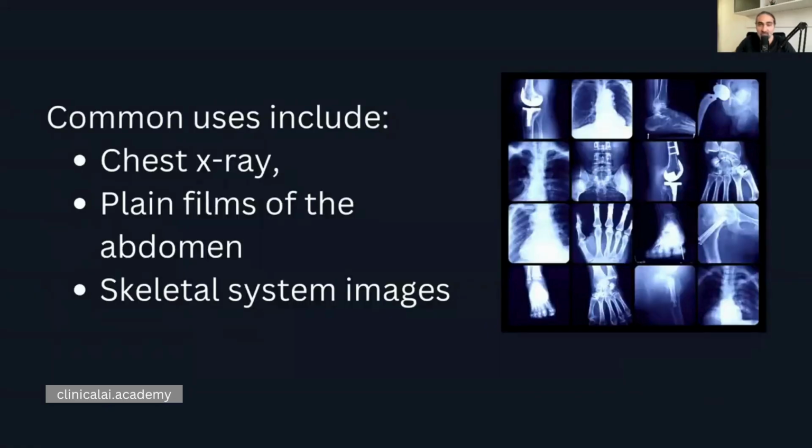It can be used for many things, most commonly used for chest X-rays, for abdomen, and for imaging the skeletal system, like bones, for fractures and to evaluate arthritis, or for evaluation of surgery and its outcome, for example, after implanting knee replacements or hip replacements.